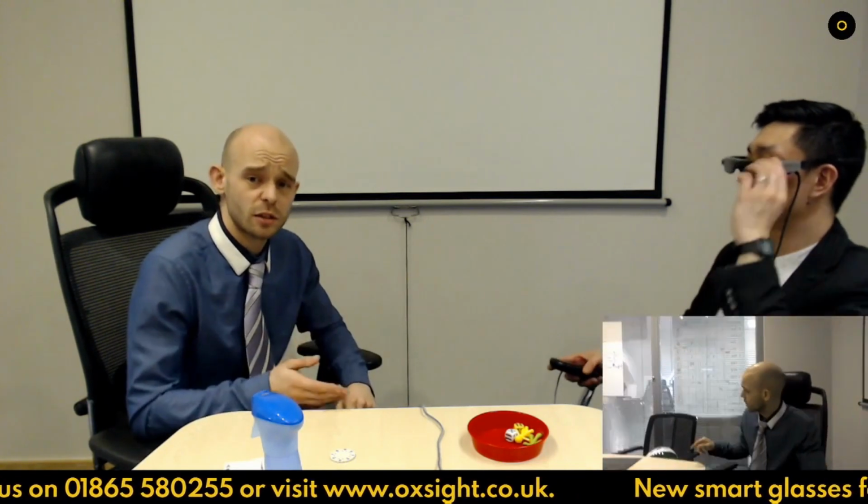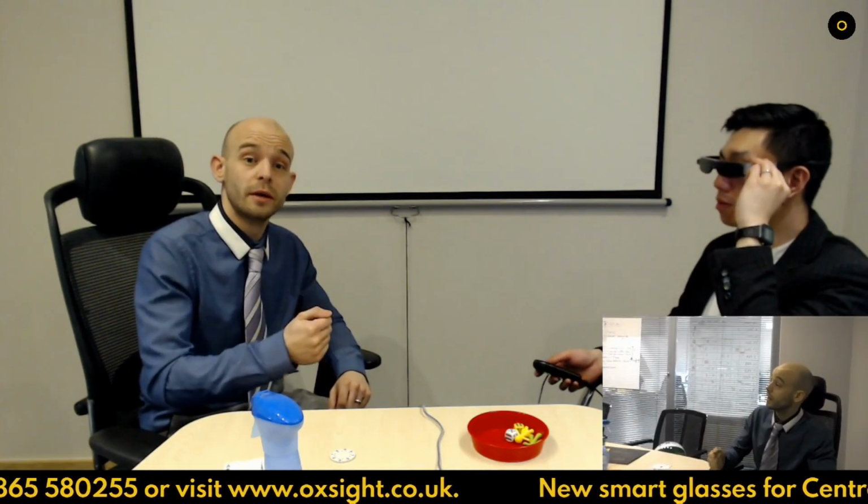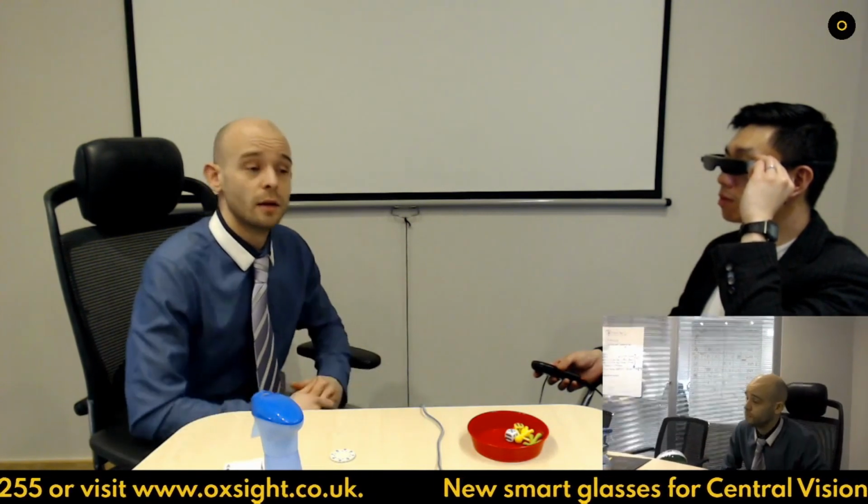You'll notice if you're in edges, you'll see little tiny specks, and you can make it more interference or less interference depending on what you want to do. Now, if you're in very low lighting, you probably want it more. You want it so that you've got a defined edge around things.